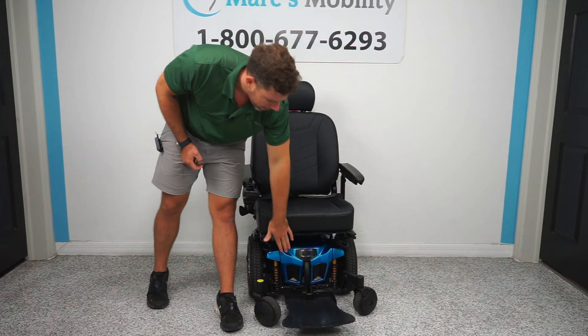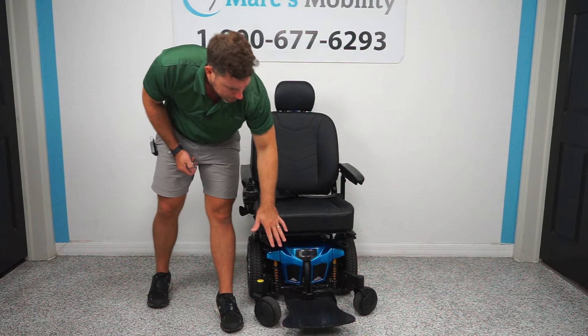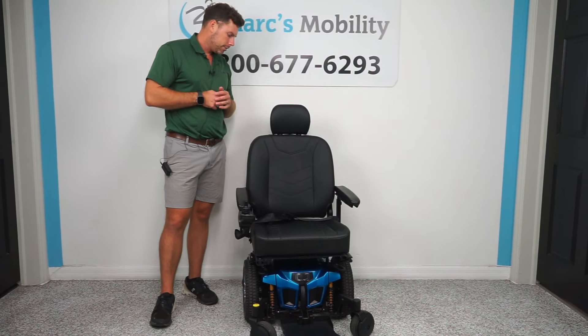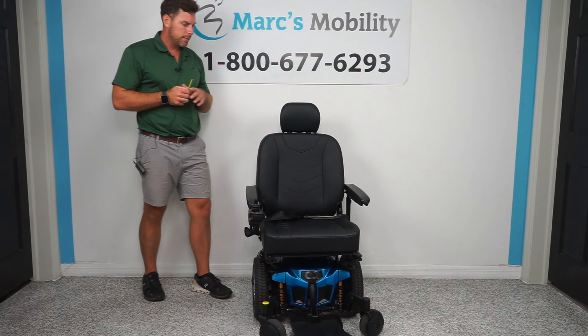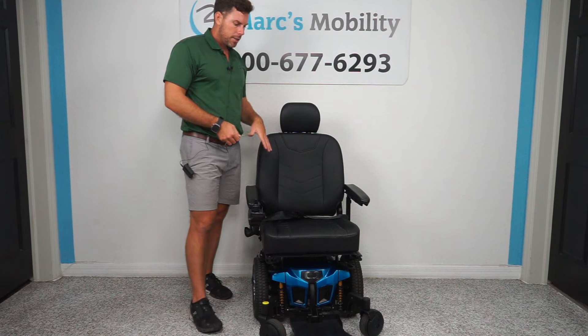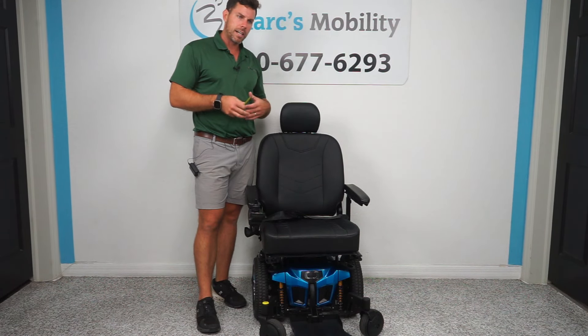The batteries do come out from the front. The Quantum Edge 3 takes 55-amp deep-cycle batteries, and we are able to ship those to your home if you are in need of them. Now, I'm going to take it outside, sit in it, drive it around, drive it through some grass, and just kind of show you what I look like on this chair.